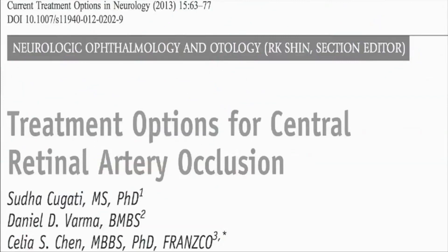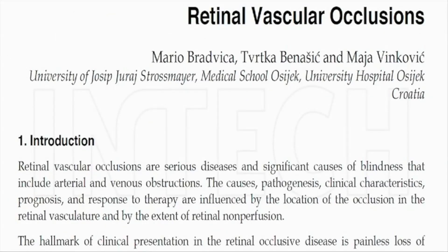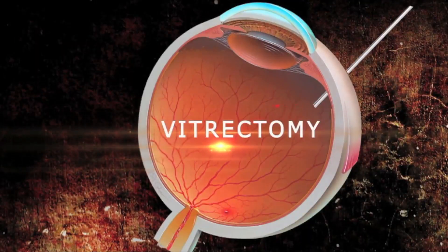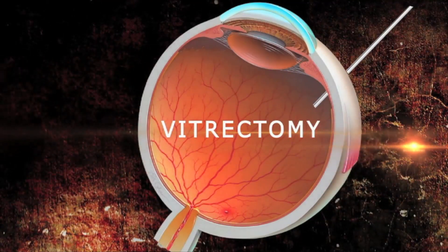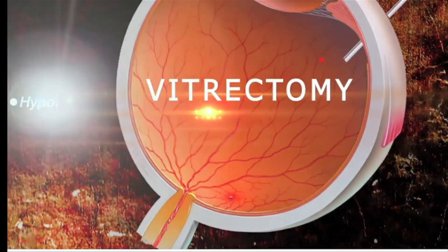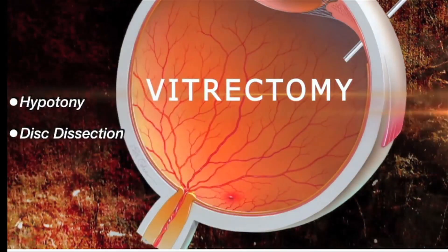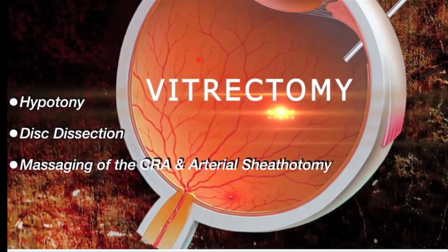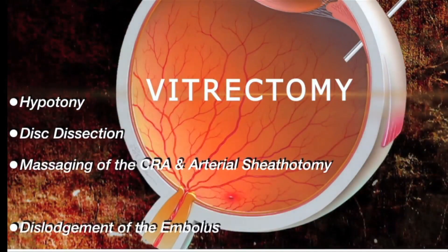Studies have shown that these therapies do not give significant amelioration in most cases. Given the limitations of medical therapies, vitrectomy promises to be a potential treatment option for this condition. Here we present a surgical technique using a combination of low IOP vitrectomy, disc dissection, and arterial massage, which helps in dislodging the embolus causing the CRAO.